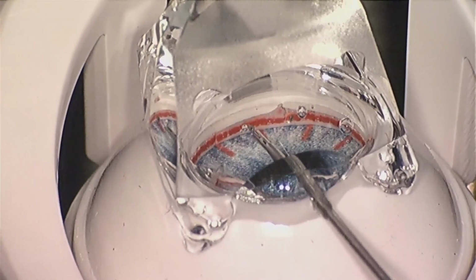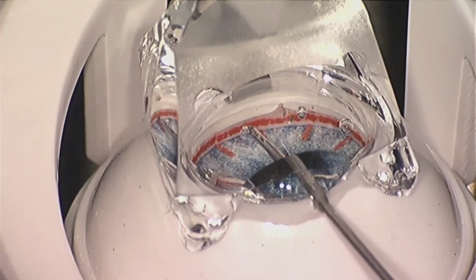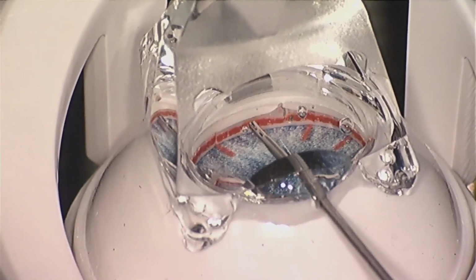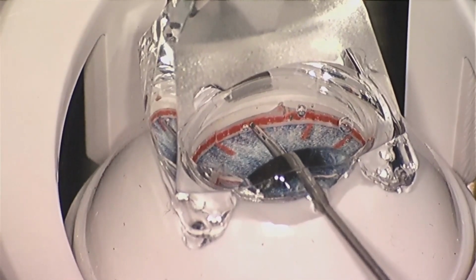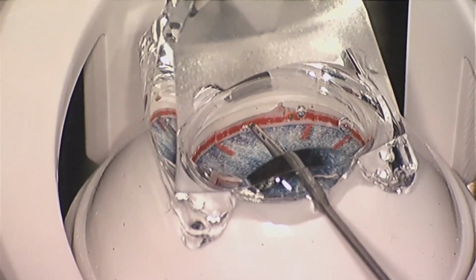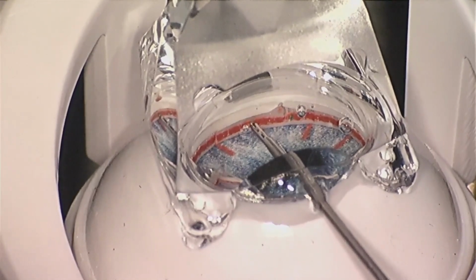So what I do is just take a deep breath and gently insert the trocar back into the inlet because it's facing me. I've got it in good position, and once I've got it engaged, then I'll just re-engage the trabecular meshwork with the trocar, having the stent in good position, and then I'll fire again.